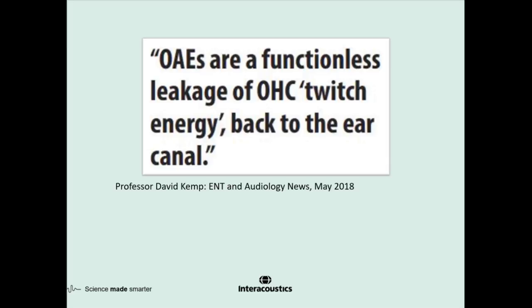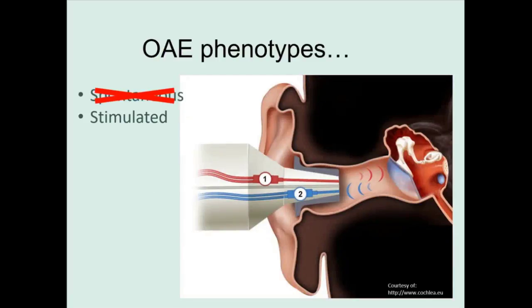If they're not present, then we know that the thresholds are impaired, and we're now looking at a sensorineural hearing loss, and the amplification that is required will need to use some compression in order to fit the entire dynamic range of sound into the remaining available hearing range.